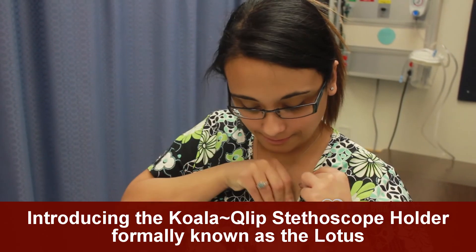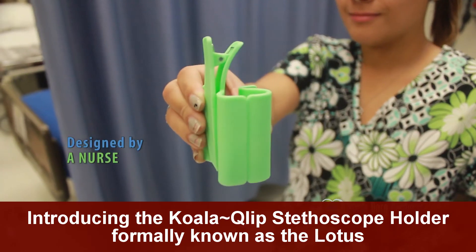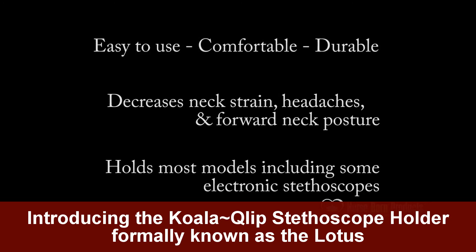It keeps your top-heavy stethoscope from flipping forward and onto the floor, and is constructed of durable plastic and two springs. The Lotus is the best way to keep your stethoscope readily available and safe while on the move in a work environment.